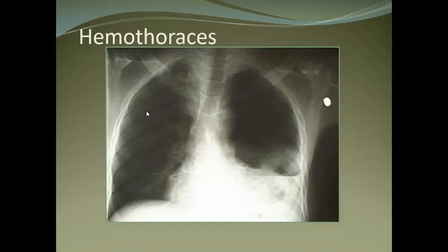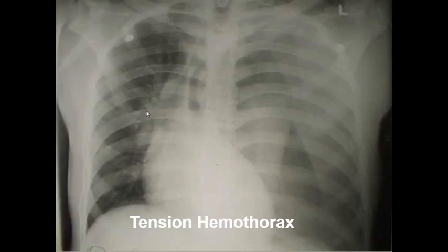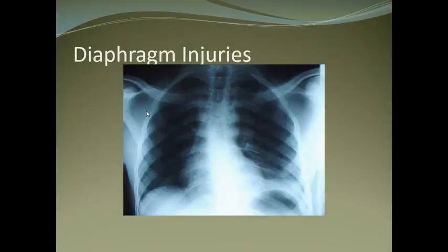Hemothorax means the pleural cavity is filled with blood. Tension hemothorax is an emergency — whether tension hemothorax or pneumothorax, the patient is in a compromised state with shortness of breath. The immediate action is to insert a chest tube into the ipsilateral pleural cavity. Diaphragm injuries, usually seen in road traffic accidents, show bowel loops in the chest cavity with irregular, shaky, and elevated diaphragm.